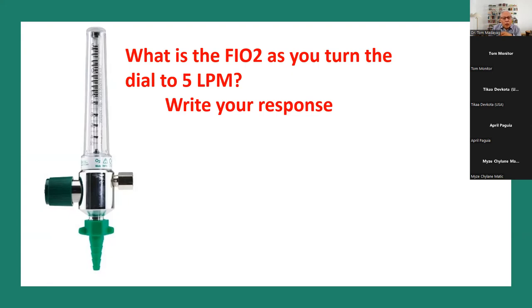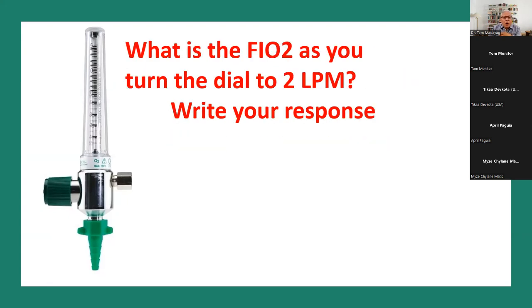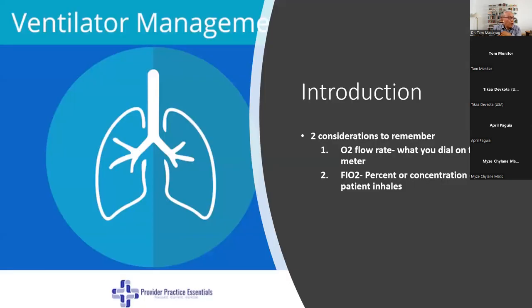Okay? So having understood that, what we're going to talk about now is principles of oxygenation in relationship to delivery devices. So we're going to talk about two concepts: oxygen flow rate, what you dial on the flow meter, and the FiO2. FiO2 is the fraction of inspired oxygen, which is the percentage or concentration of oxygen that the patient inhales.